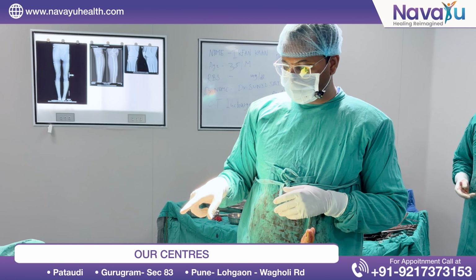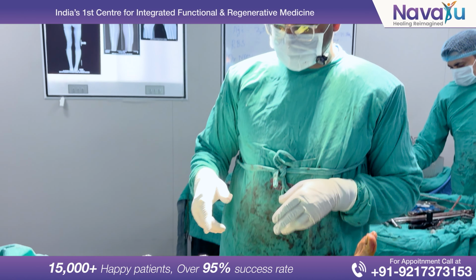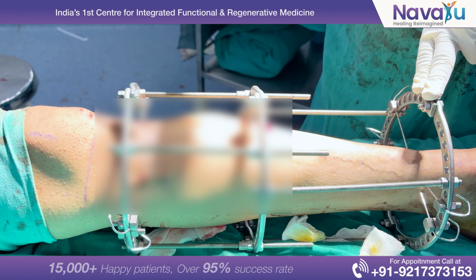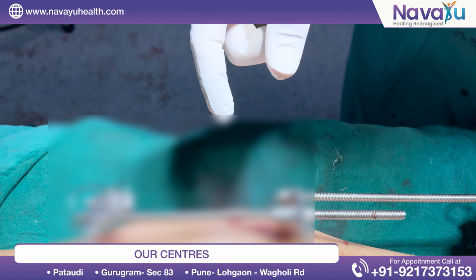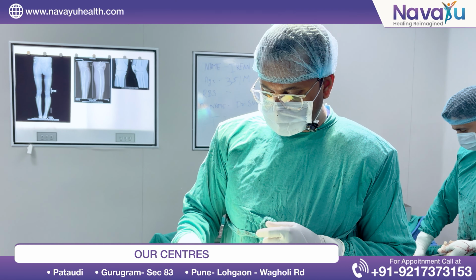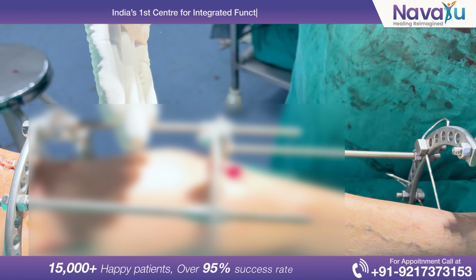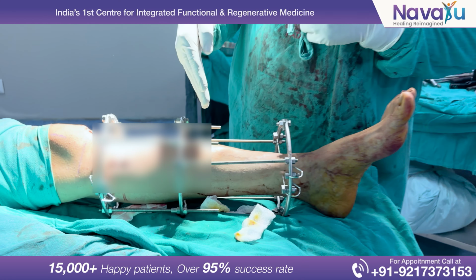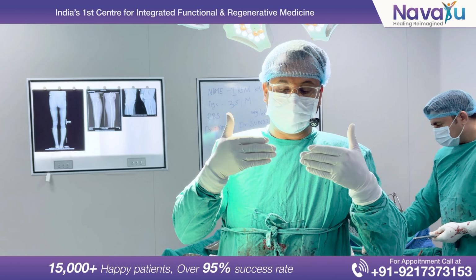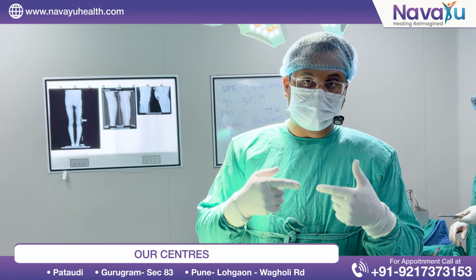So guys, here surgery is complete. We have corrected the deformity, and this is the LON method. We have fixed the Ilizarov. You can see here, this is the nail site from which we have entered the nail. First we cut the fibula and did the osteotomy, because it was already deformed, so we needed to cut a piece of fibula, and then this is the site from where we corrected the deformity. It is not like normal LON where we usually go for osteotomy at the proximal side, but here we need to go at the CORA, the level at which there is deformity. So we made a transverse osteotomy at the CORA and corrected it.